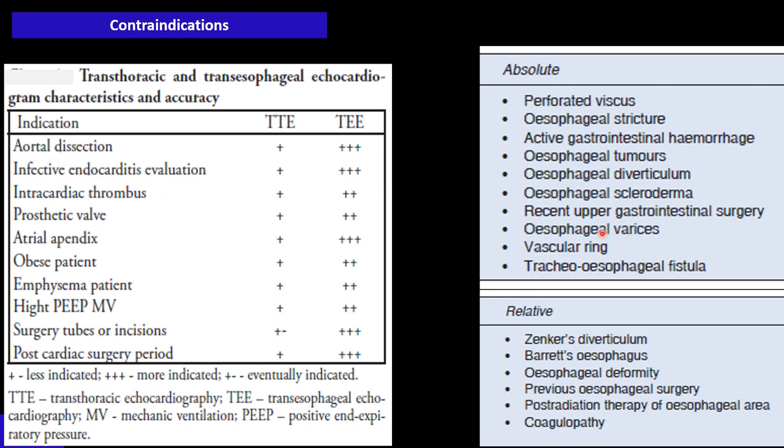Contraindications for TEE are the same as contraindications for endoscopy. Anything that can increase the risk of rupture or trauma to the esophagus, up to the stomach, is a contraindication. There are absolute contraindications and relative contraindications. You can pause it and study by yourself.